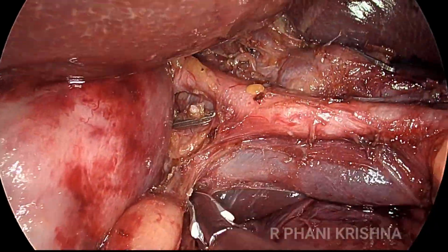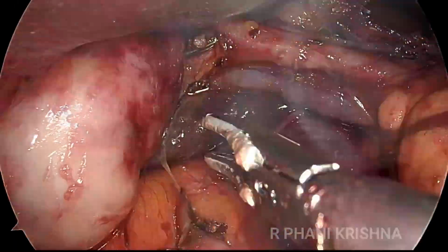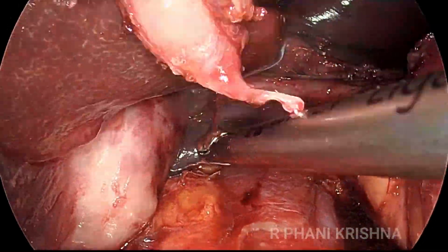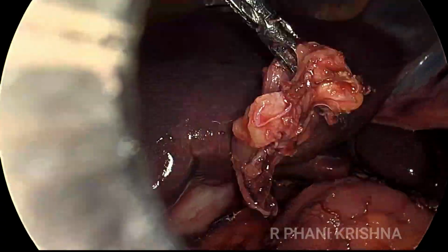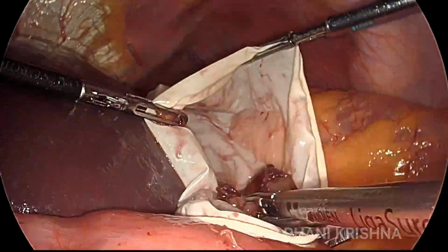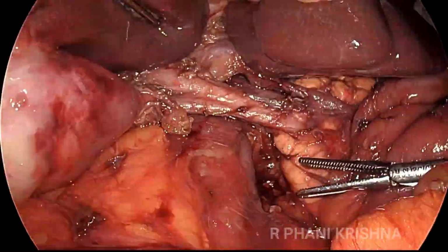Again, working on the portal vein surface and working on the hepatic artery surface is what makes this lymphadenectomy very safe and simple. So this is the extent of lymph node dissection in gallbladder cancer. The retroportal nodes have been sampled here.